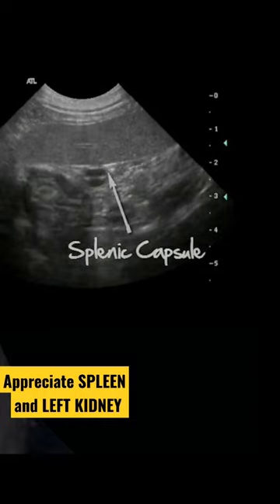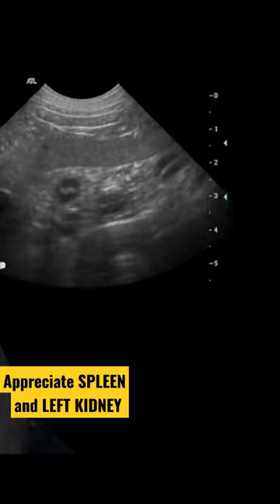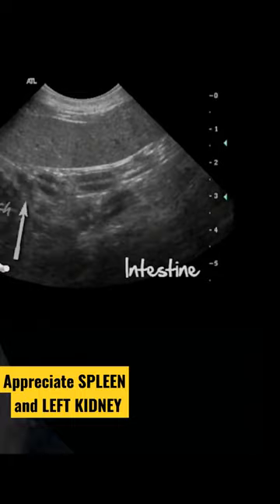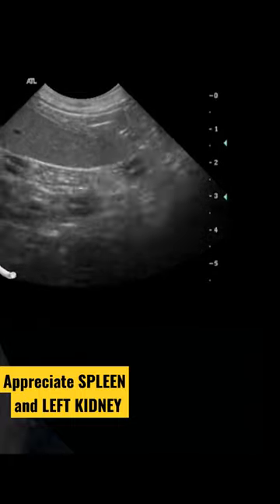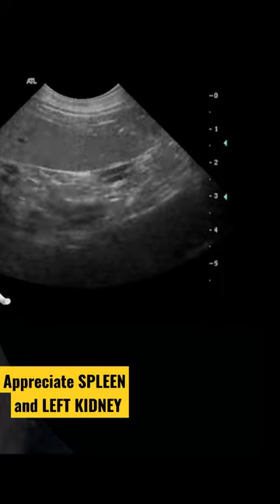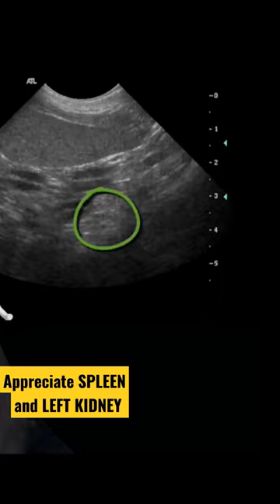Dorsally, you can see a few intestinal loops caudal to the stomach. These intestinal segments are loosely distributed in the mesenteric and omental fat that shows scattered hyperechoic lines.